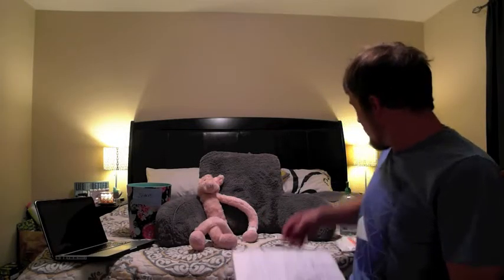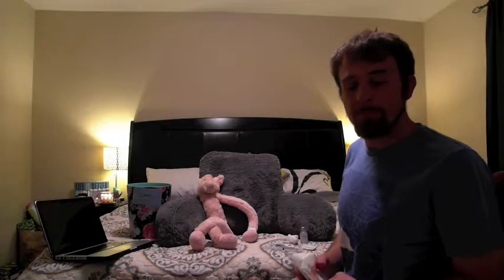Hello, my name is Kevin, and today I'm going to be demonstrating giving an intramuscular injection into the deltoid of my patient here. Before you're administering any drug, you want to make sure that you have all your supplies.